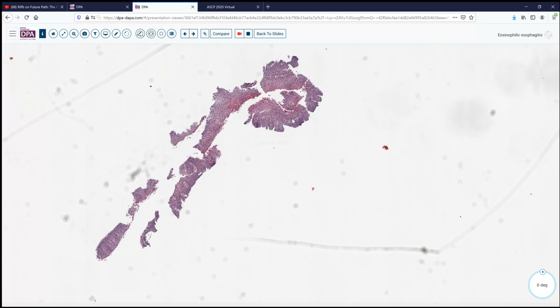Then as we come into higher magnification, we see that as well as that white space, there's also a lot of interstitial pink cells here. And as we look at higher magnification, we can appreciate that some of these have sort of a bilobed nature of the nucleus, and these are eosinophils. As well, we might see there are a few lymphocytes present here. This certainly appears to be a very active esophagitis with lots of eosinophils, lots of edema, and perhaps some degree of compensatory hyperplasia going on here as we don't have much normal surface epithelium.